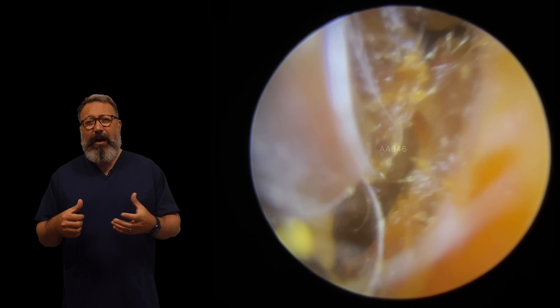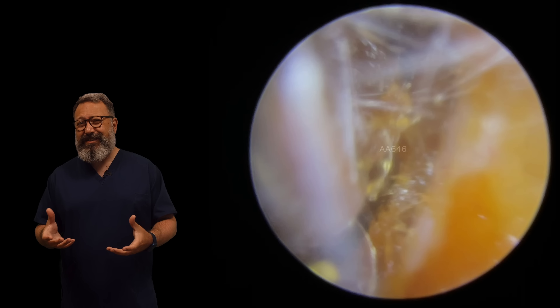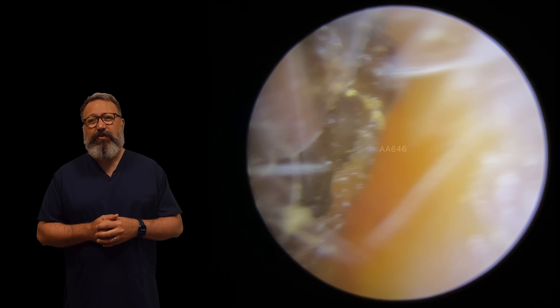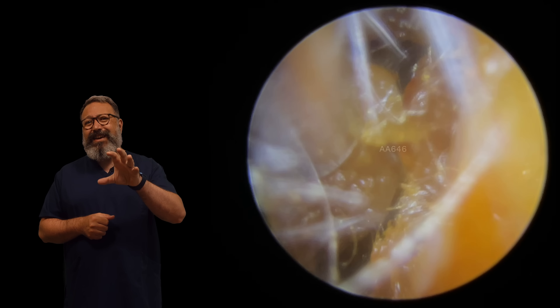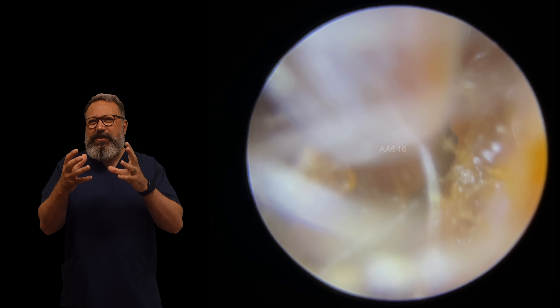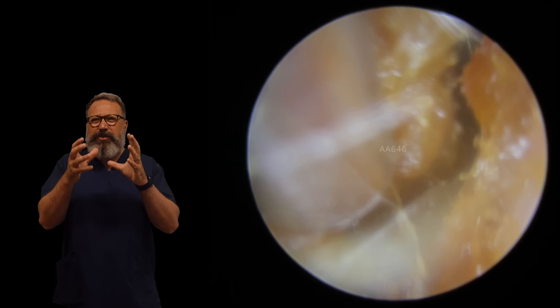If it's very deep or it's a very large plug, then drops are really not going to cut it a lot of the time. They're good for preparing you for coming along for something like this, but they don't always get rid of it. What we can see here is a really difficult consistency to describe. It's kind of almost like a clay wax, but just that little bit softer.